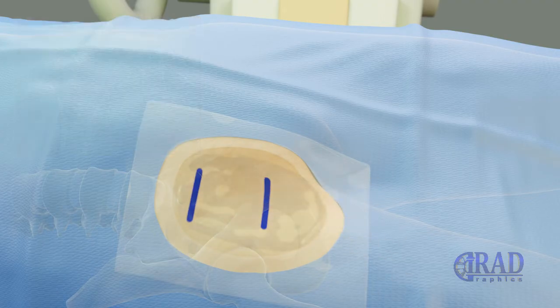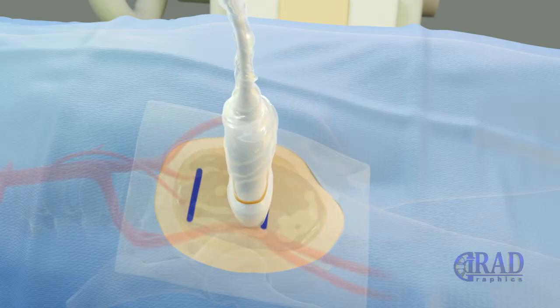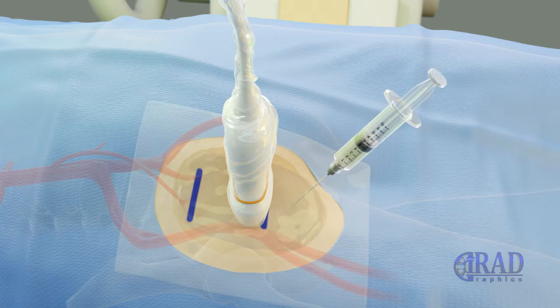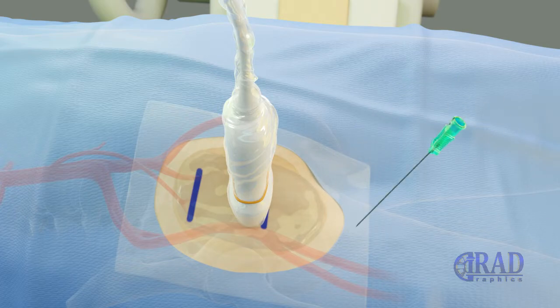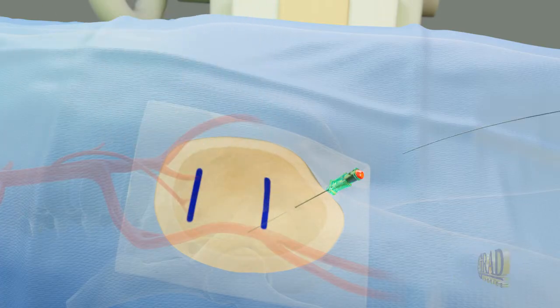As the first step, skin in the right groin area is marked based on the upper and lower margins of the right femoral head. Once the location of the common femoral artery for access is picked up under ultrasound, the skin entry site is numbed by injecting lidocaine. Then, the right common femoral artery is accessed under ultrasound guidance using a micropuncture needle. Once the blood return is noted, a microwire is advanced through the needle into the right common femoral artery.